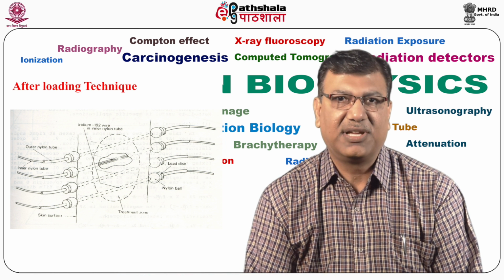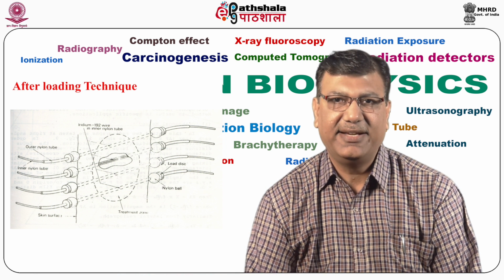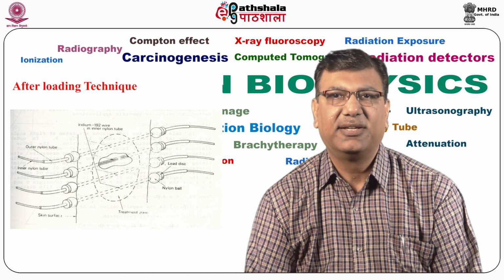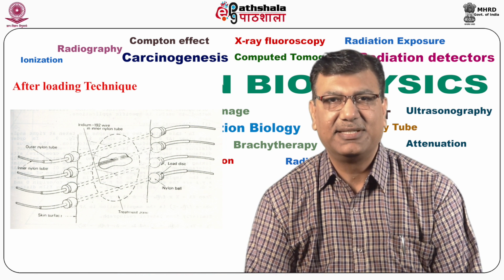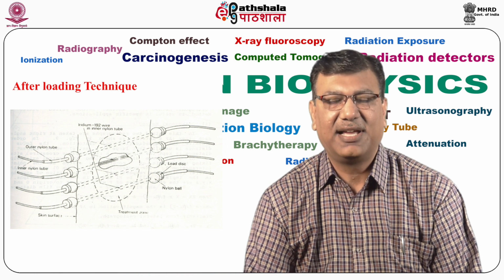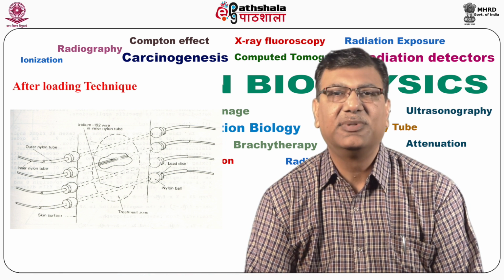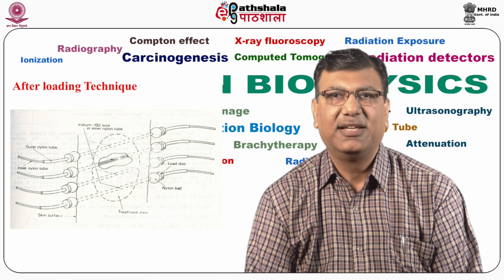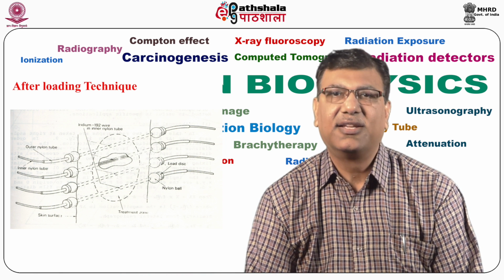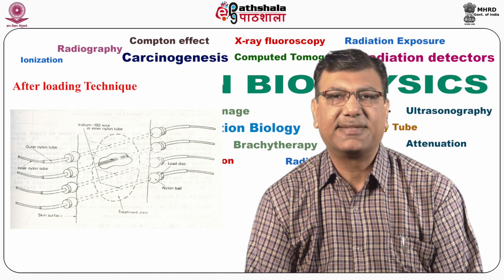This figure shows afterloading techniques. The applicators are inserted or implanted at the respective places, and then images are taken, either orthogonal images or, most of the time, CT images, and sources are loaded according to that after planning the case.